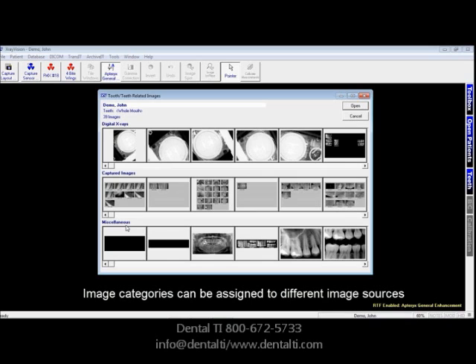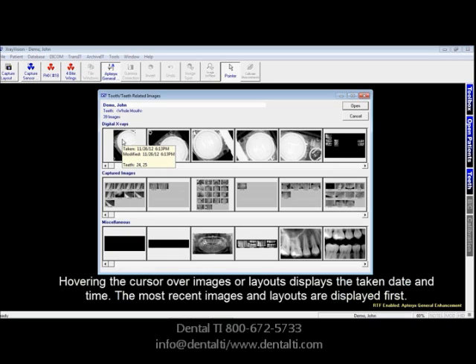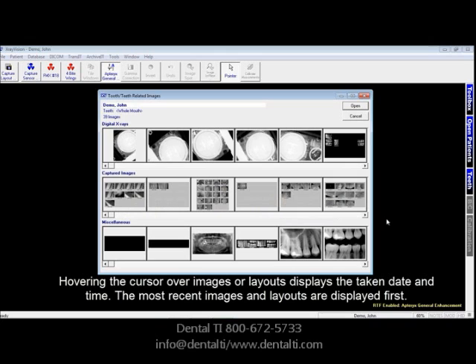That category, by the way, is changeable within the software. Notice when we put the cursor on top of the image, the date shows up as well as the time taken and the tooth numbers. The most recent is always shown first, and then sequentially it goes down.